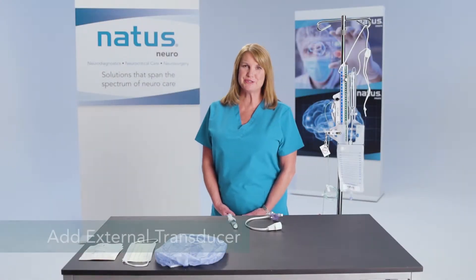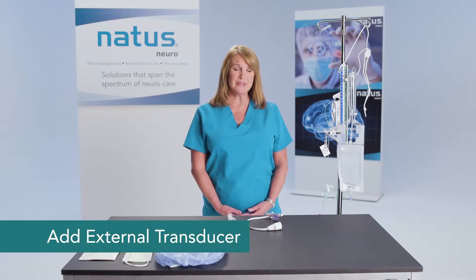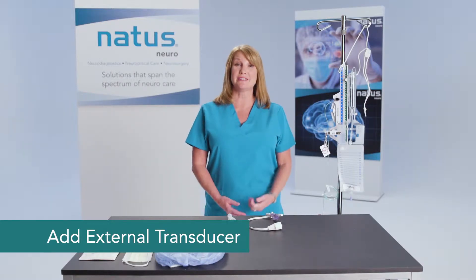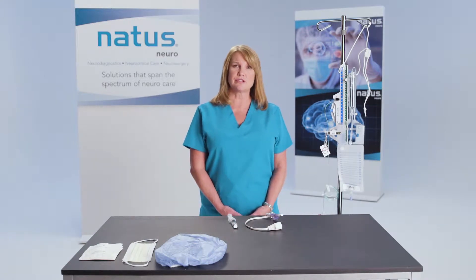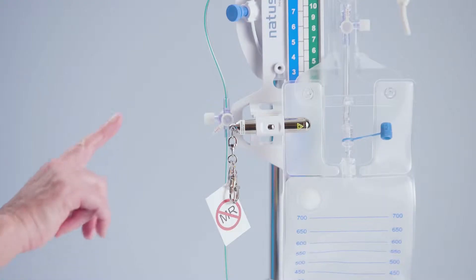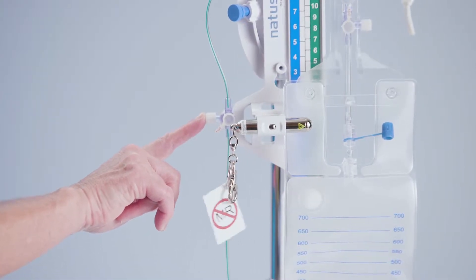The next step is to add your external transducer to the system if your intention is to monitor intracranial pressure. If you're not going to monitor intracranial pressure, it's best to leave the end cap at the system stopcock in place.